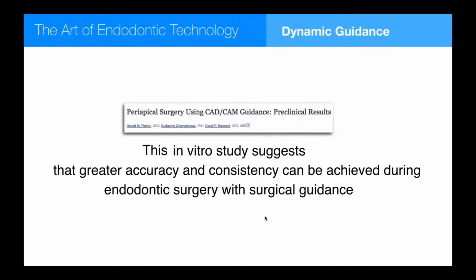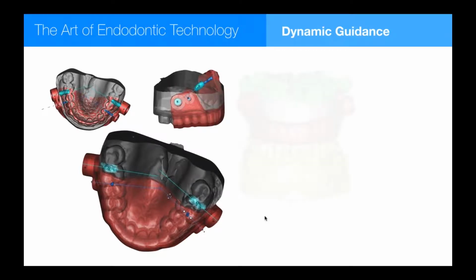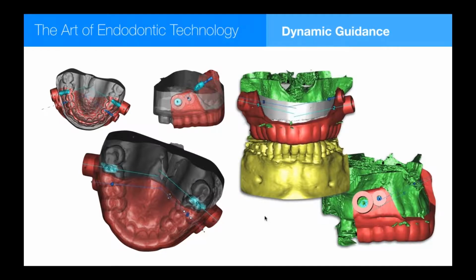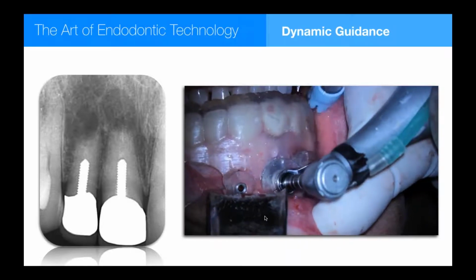There are some other problems. However, all the research on implant guidance and on guidance in endosurgery with static drill guides shows that we're far more accurate. A lot of the implant surgeons, especially the young ones, don't think they need drill guides, but if you talk to Gene Triplett, who runs the Baylor program, he goes, they don't think they need drill guides, but I have to deal with their cases after they leave the grad program, and trust me, they need drill guides. So it's not any different for me as it is for the implant surgeon.